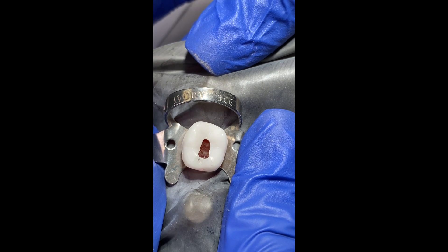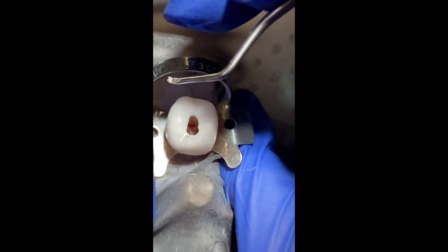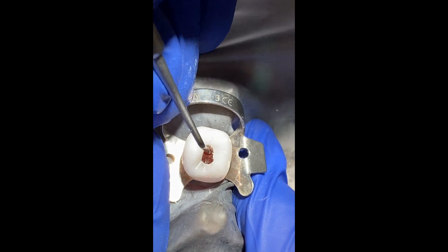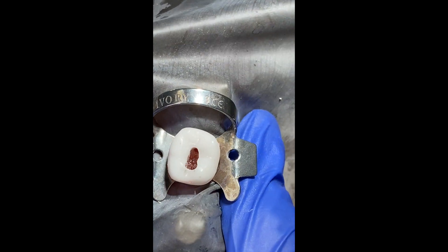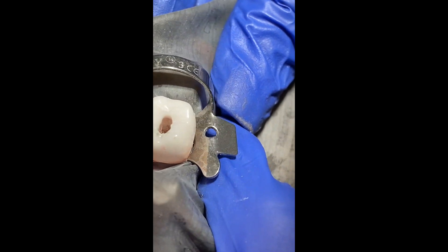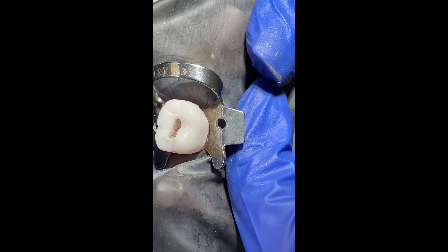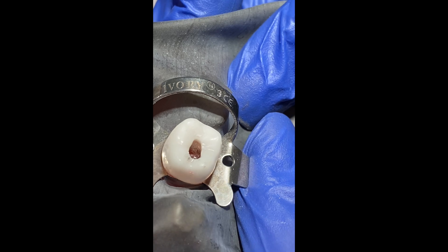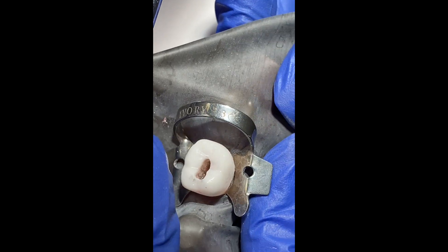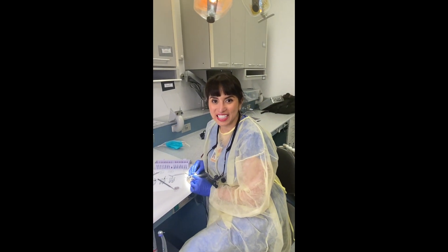That's about what you want for a nice conservative prep. Take your endodontic spoon excavator and rub up on the walls to ensure that you have no catch — this allows you to confirm that you have removed all of the pulp chamber roof. Remember, if you see red you're dead. We can see there is no red, so there is no more pulp material on the walls. Thanks for joining me guys, and good luck on your REB exam.